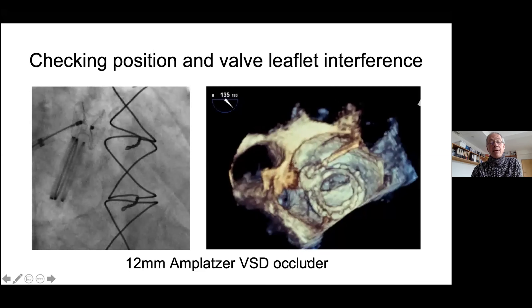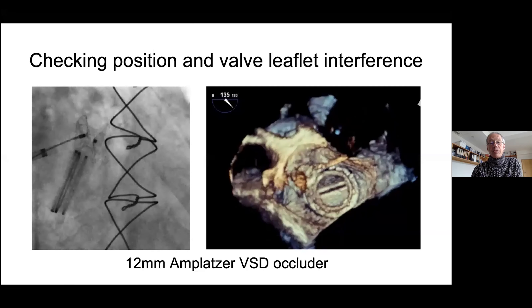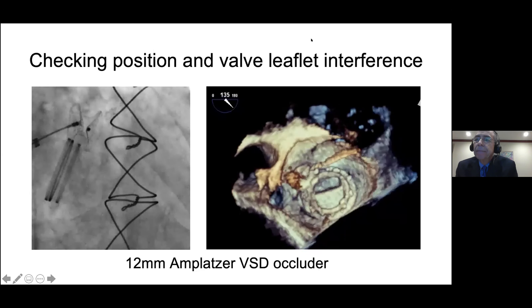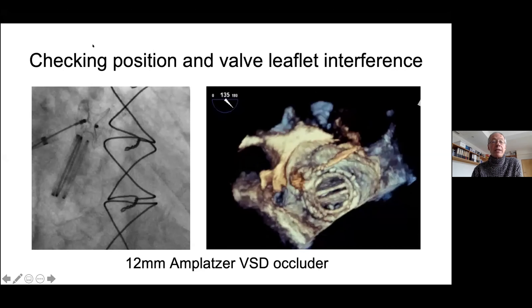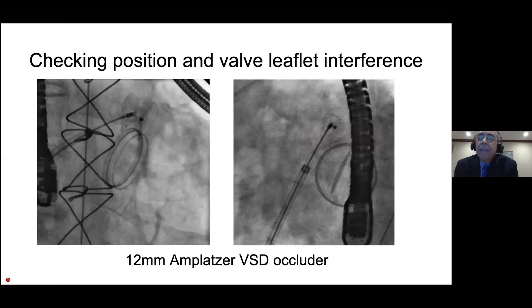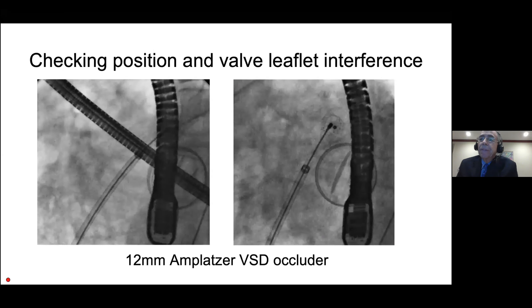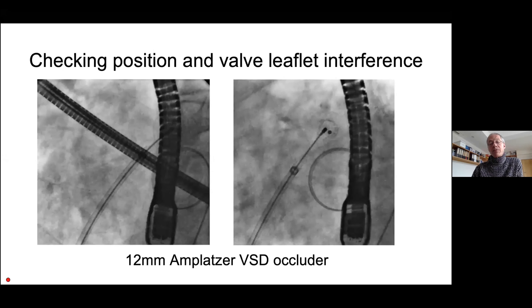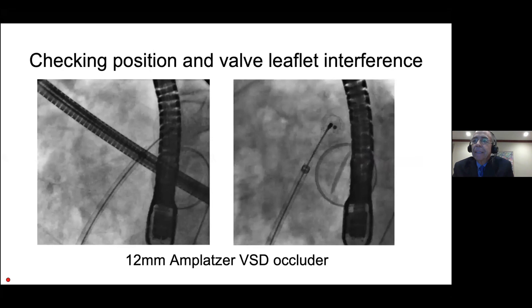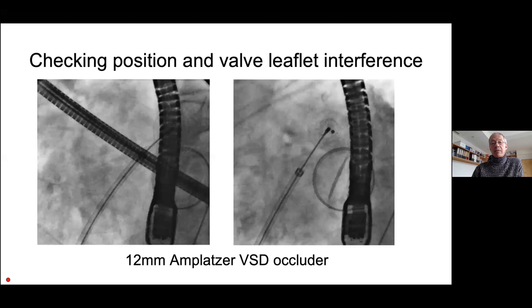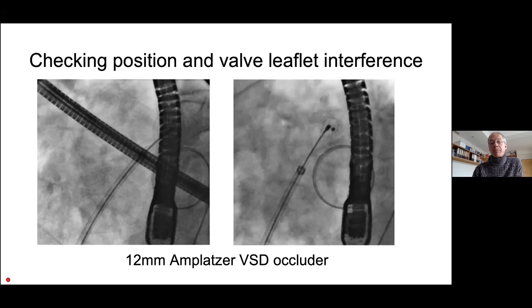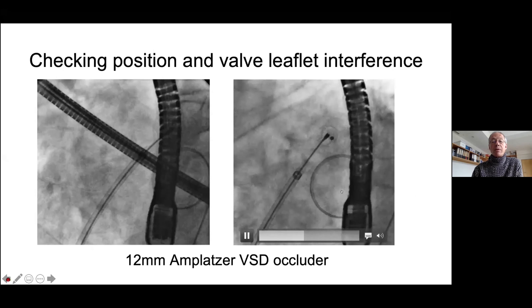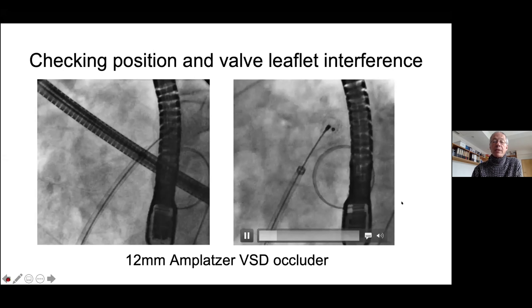Checking the position and valve leaflet interference. Everything is looking good — the leaflets are moving, and the device is in the correct position. You should check on Doppler if there is flow on the sides of the device, and see if you need to put a second device before releasing this. With VSD and PDA occluders you always see flow through the device — the question is the sides of the device. In mechanical valves it's very important to make sure the leaflets are moving freely, because you may interfere with the leaflets. I do this under fluoroscopy and echo. The leaflets are clearly moving freely.